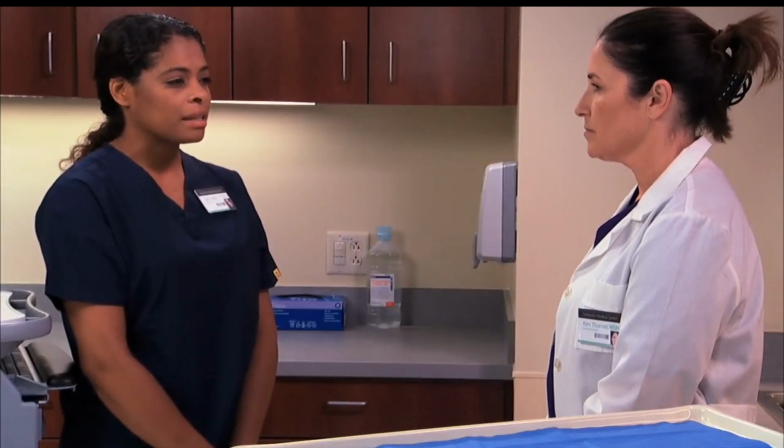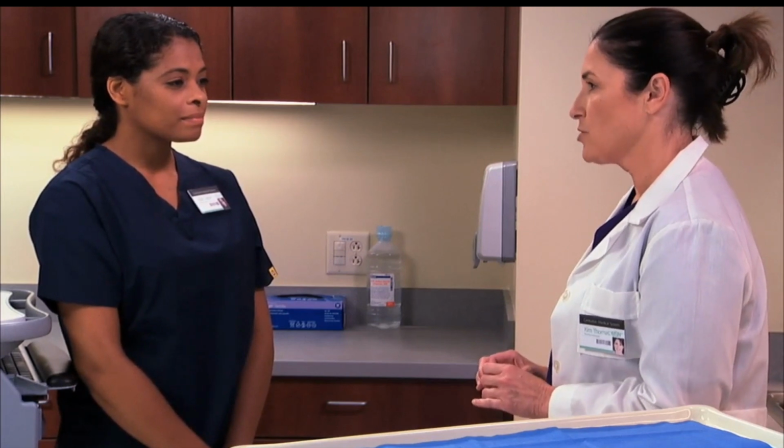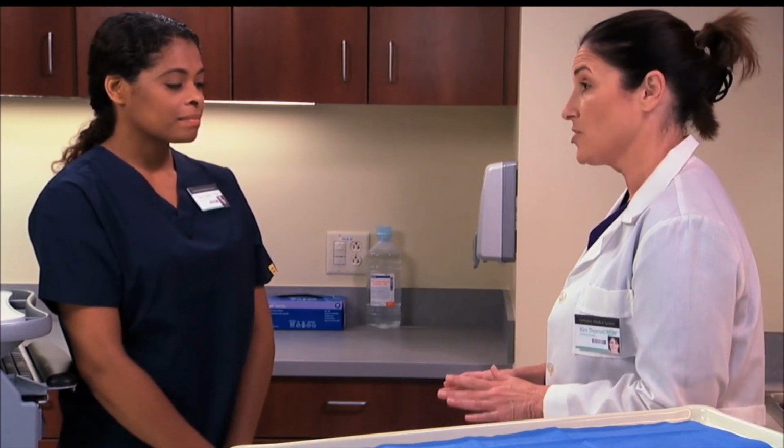Now, why do you think this is? They're readily absorbed and less likely to cause tube occlusions. Right. Now, certain solid dosage medications can be crushed and combined with liquid. These medications should be crushed to a fine powder and mixed with 15 to 30 milliliters of water before delivery through the tube. But before you do this, be sure to consult your drug administration guide because not all medications can be crushed. I remember reading that. If a tablet has a special delayed release coating, it cannot be crushed.